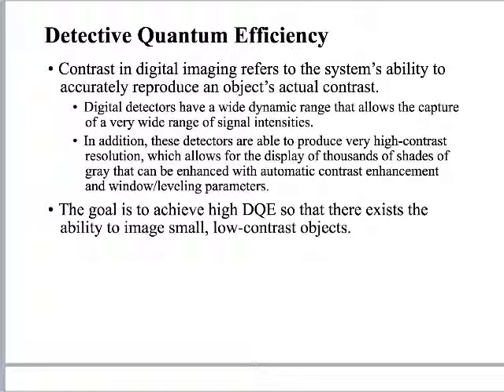So the name of the game for digital imaging going forward is to increase DQE, increase detective quantum efficiency, and allow us to have greater and greater amounts of low contrast resolution. Low contrast resolution. I guarantee you something like this will be on the test. This is a major point. So let's sit on this for just a sec and talk about why this is important.